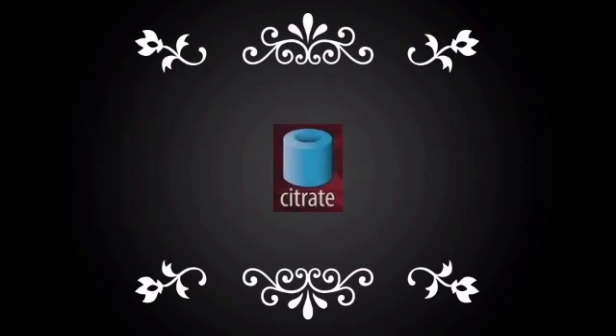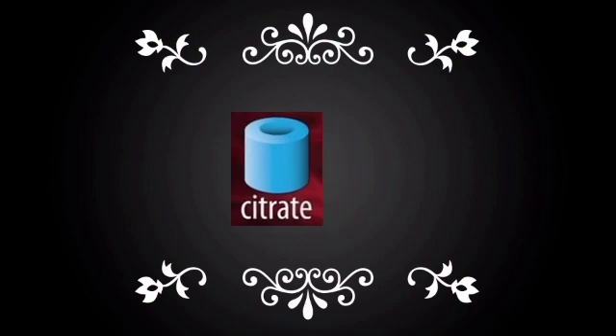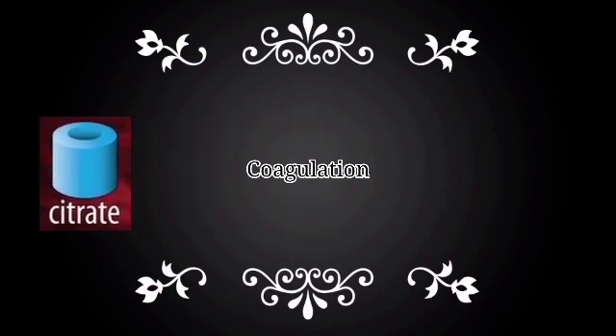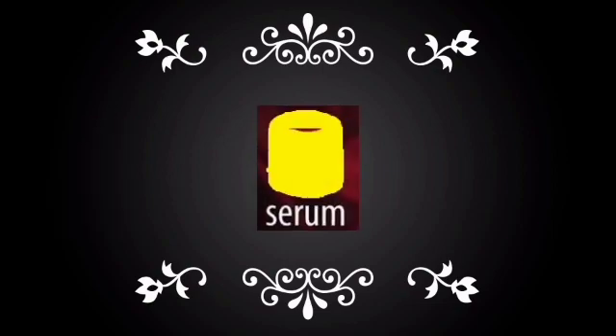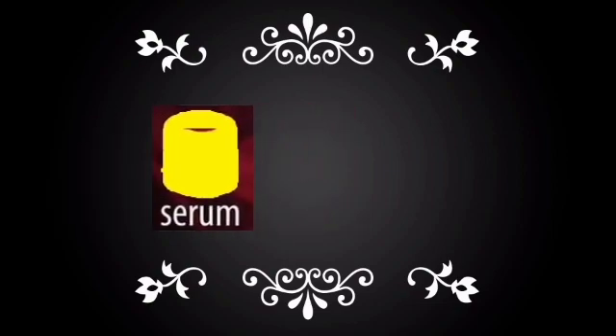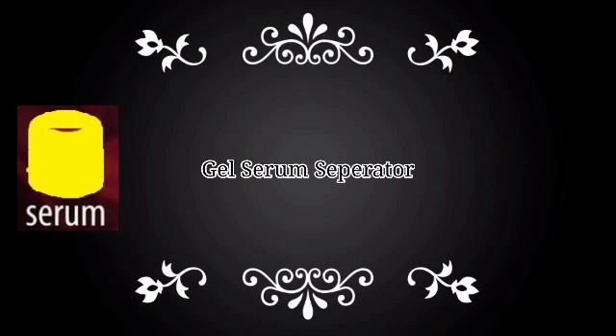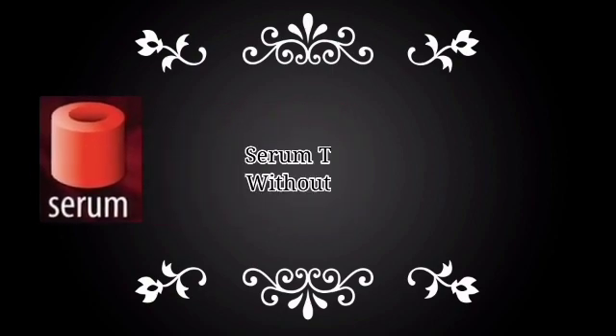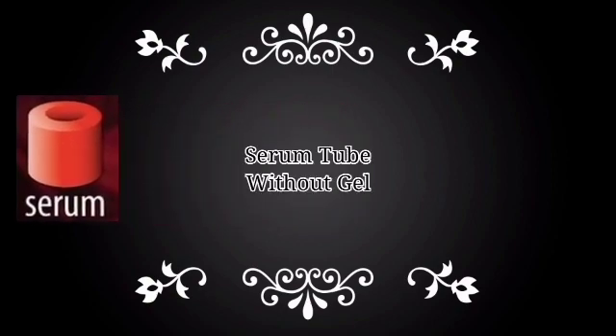The second tube is the citrate tube, which has a blue color cap and is used for coagulation studies. The third tube is a gel separator tube for serum — these are yellow color tubes. The fourth tube is again a serum tube but without a gel separator, and they are of red color.